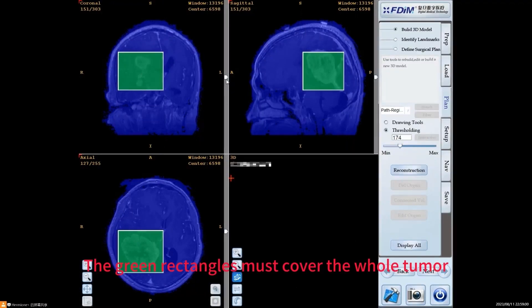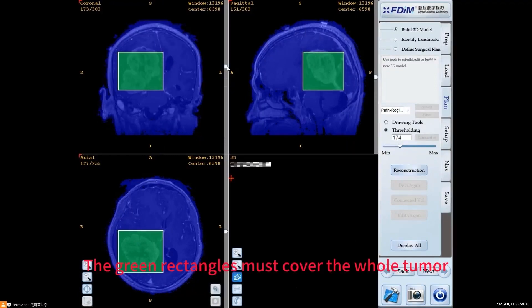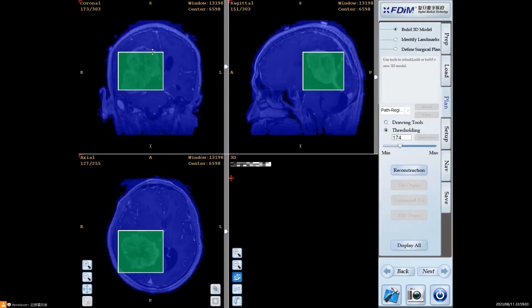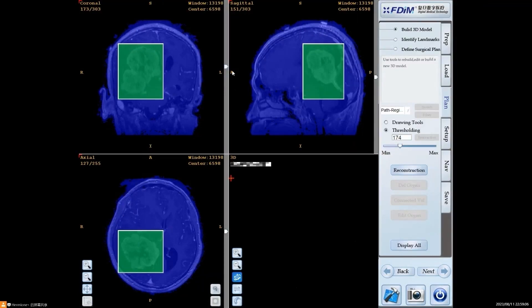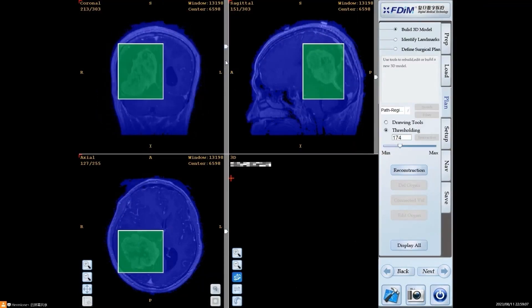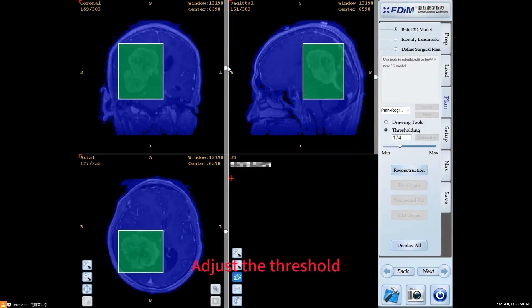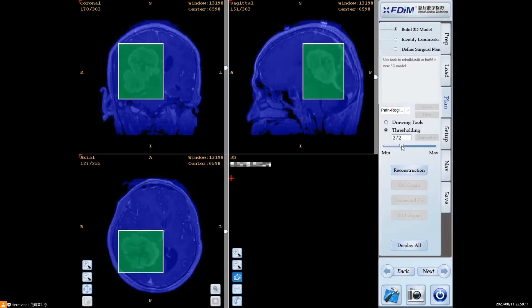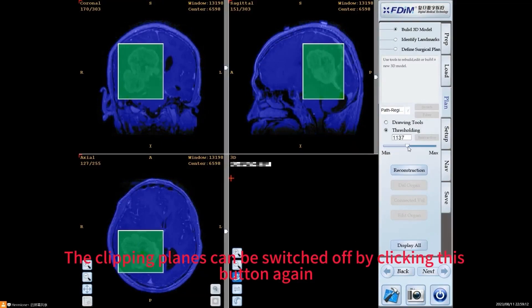The green rectangles must cover the whole tumor. Adjust the threshold. The clipping planes can be switched off by clicking this button again.